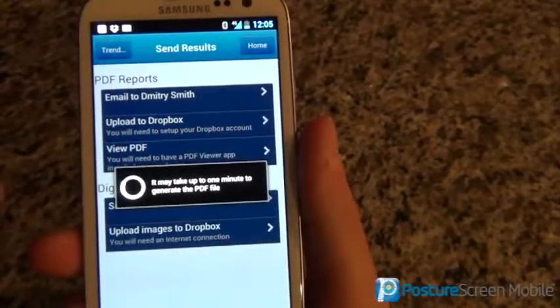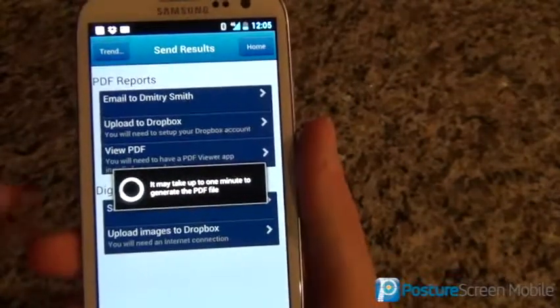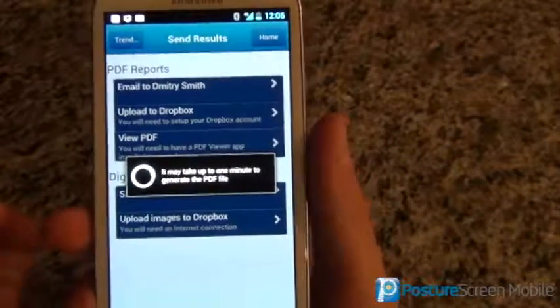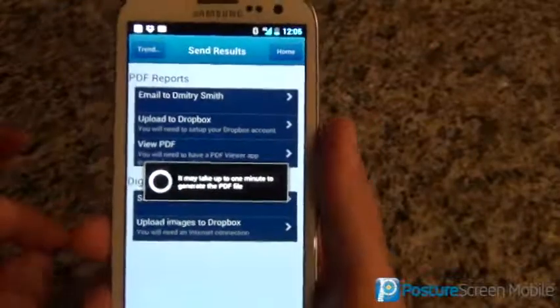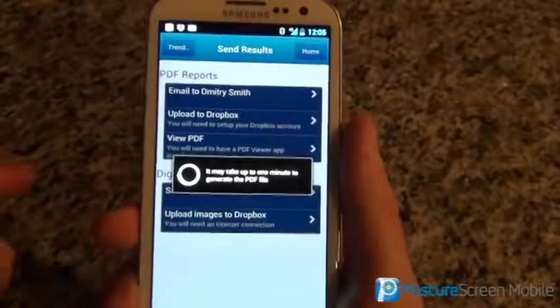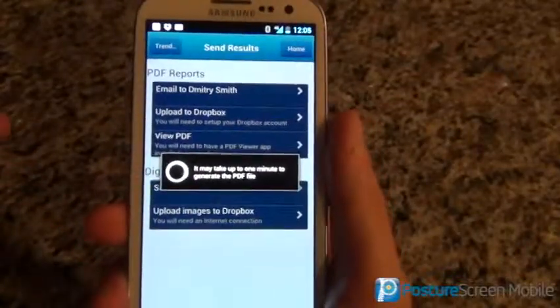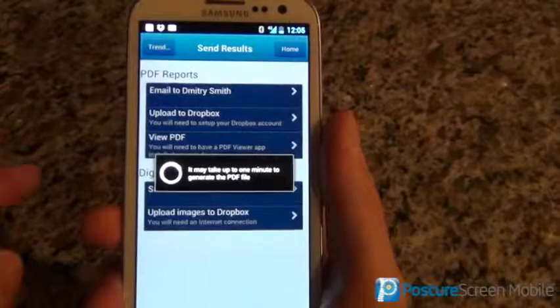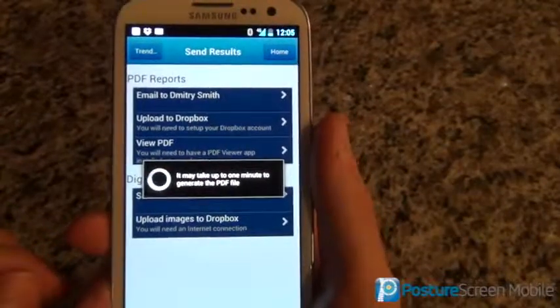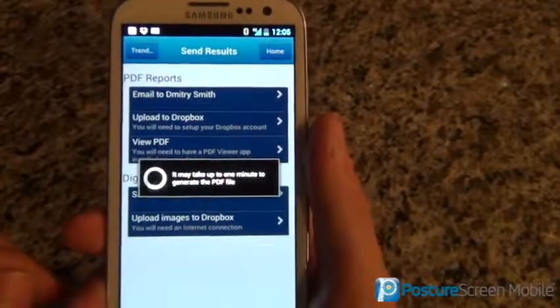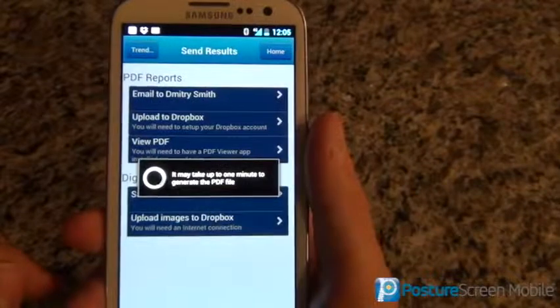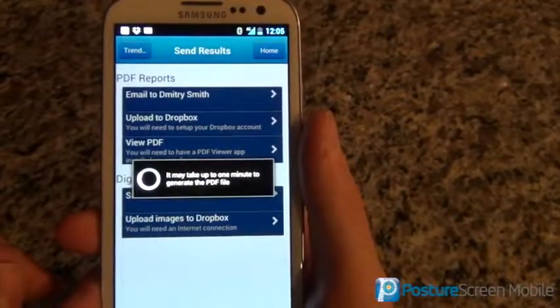This will take a little bit longer because PDF generation on Android is extremely slow. This is, in fact, a limitation right now with the current PDF generation software built into Android.